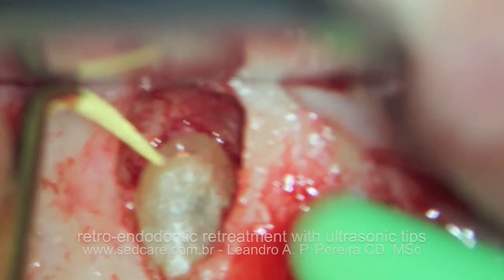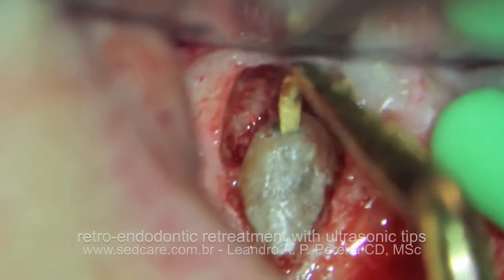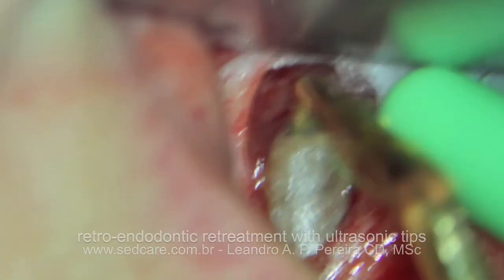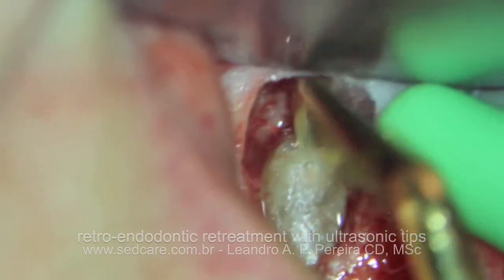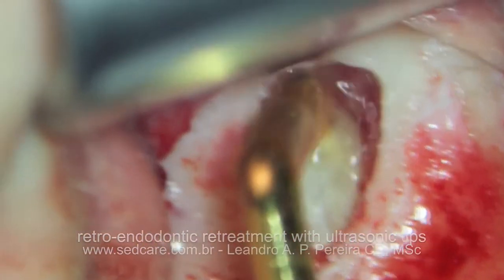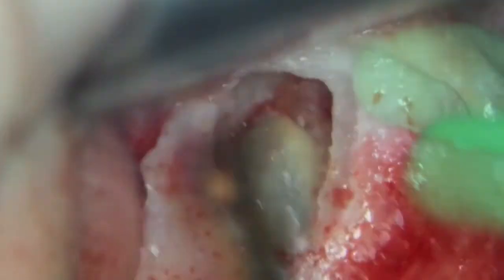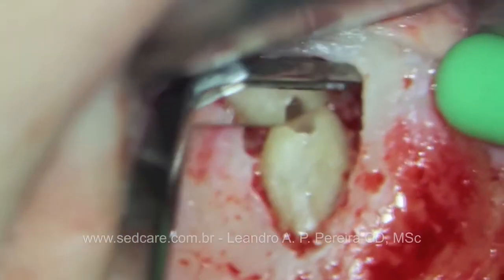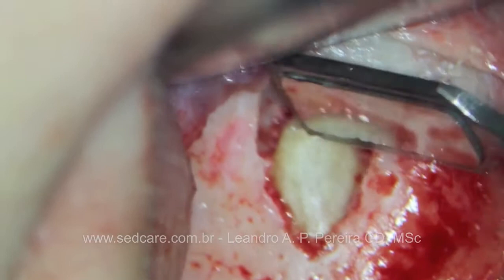Special tips that are angled in a special way are very good for removing canal filling materials from retrograde, as you can see here. Always use it with water cooling, and you can see it works great. And it is ready to be filled with MTA.